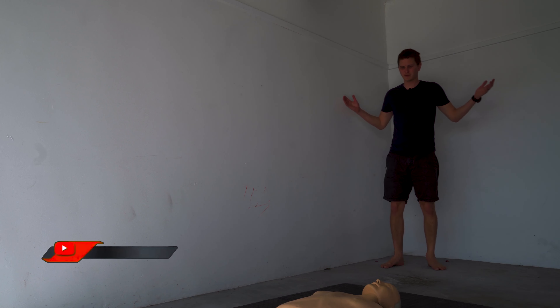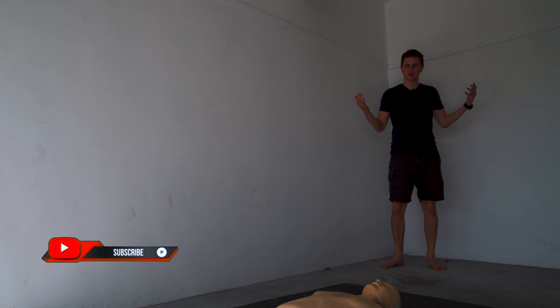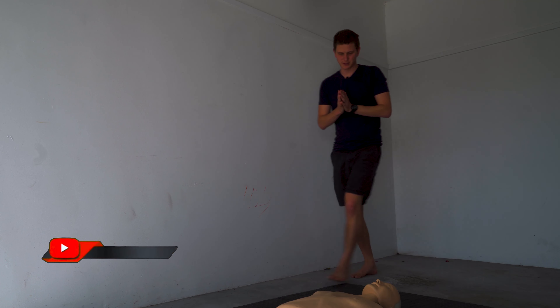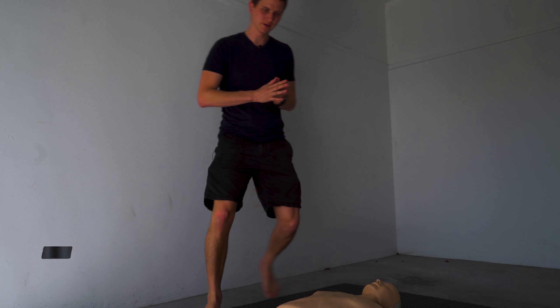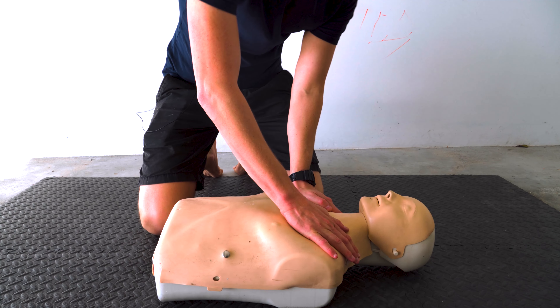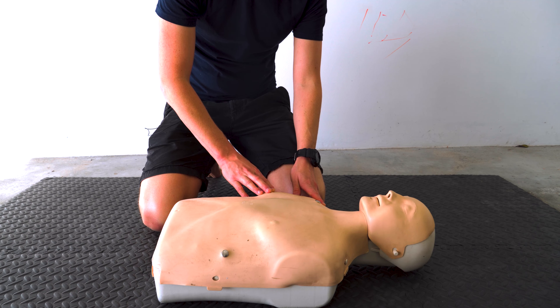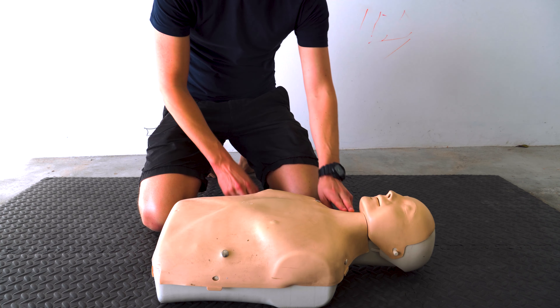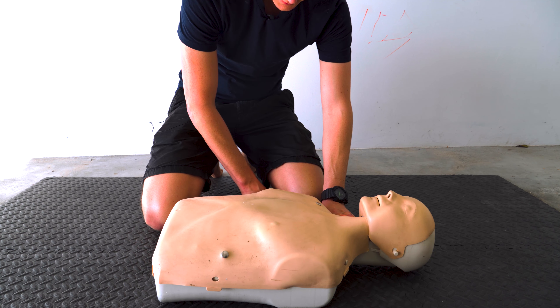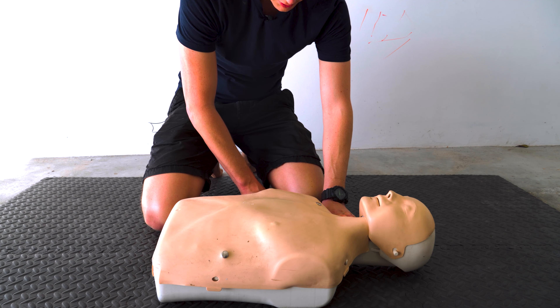I check for hazards — are there any hazards to me or to anyone around me? It's safe for me to approach. So I'm going to approach the victim. Hello? Can you hear me? Can you hear me? He's not moving. He's unresponsive. I'm going to check for pulse and look for breathing. No pulse, no breathing.